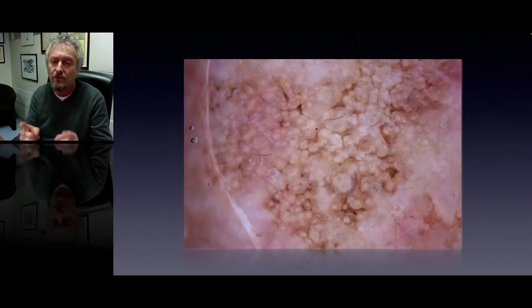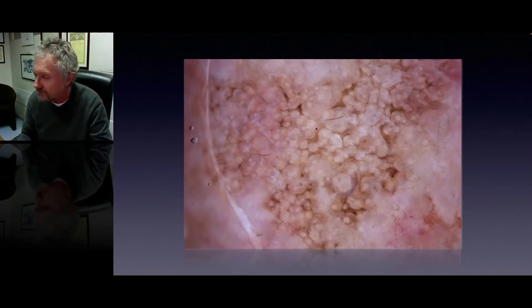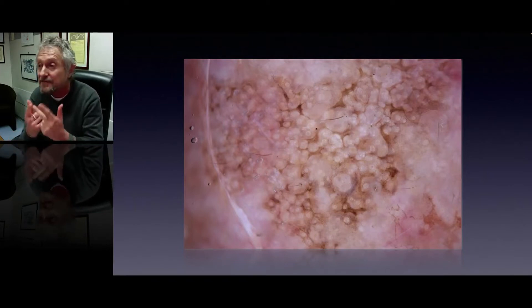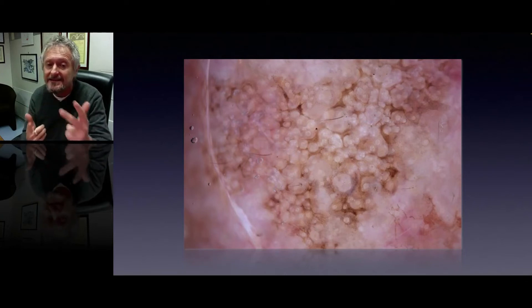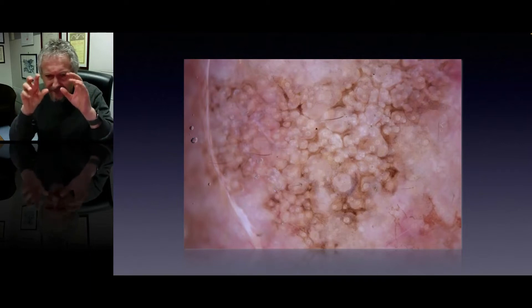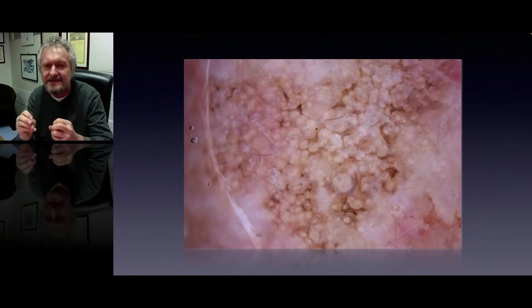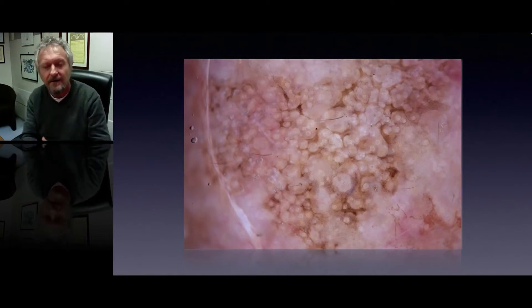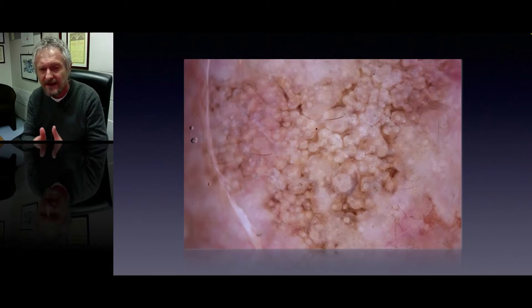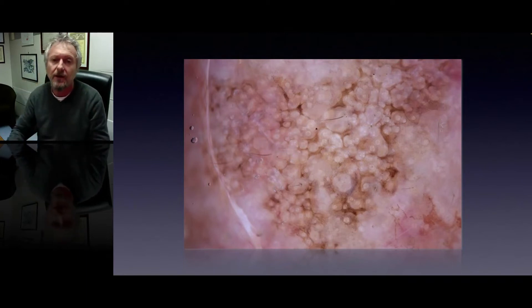Because we know what to look for: again, the white follicles, the erythema that is very frequent also in pigmented actinic keratosis, and especially this kind of pigmented scales — very superficial, very sharply demarcated reticulation. This is just pigmented scales, and you can identify that this is a very superficial pigmentation because of the sharp demarcation of these lines.